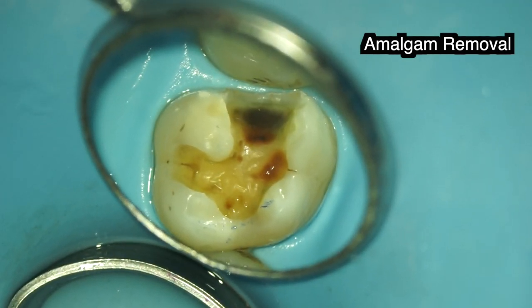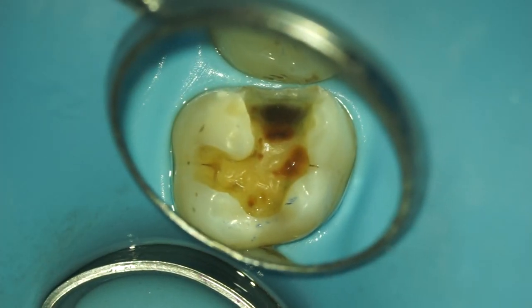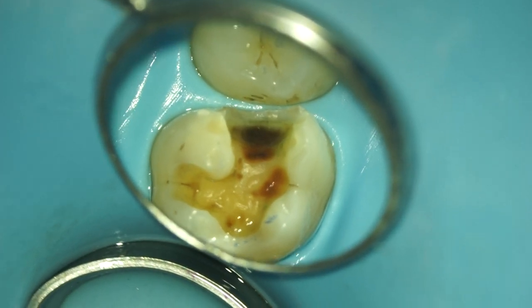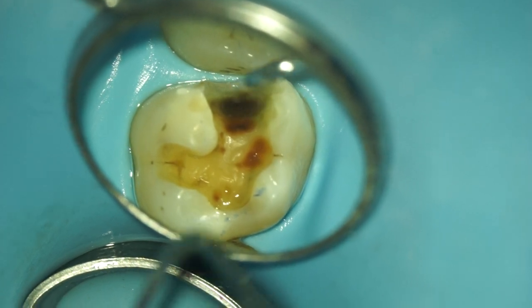The metal filling is now removed and you may notice some darker spots. This is not caries. Dentists check this with a probe. If it sounds hard and it feels hard, it is not caries. We call it cri de la dentine. You will now hear me checking this.